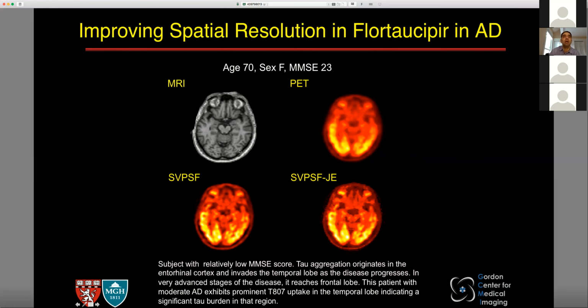I can model all of that in my PET reconstruction using patches, and I will get something like this instead of something like this. So this is my PET, and this is my PET with an MR anatomical prior. I hope you can see how nicely we improve on spatial resolution.